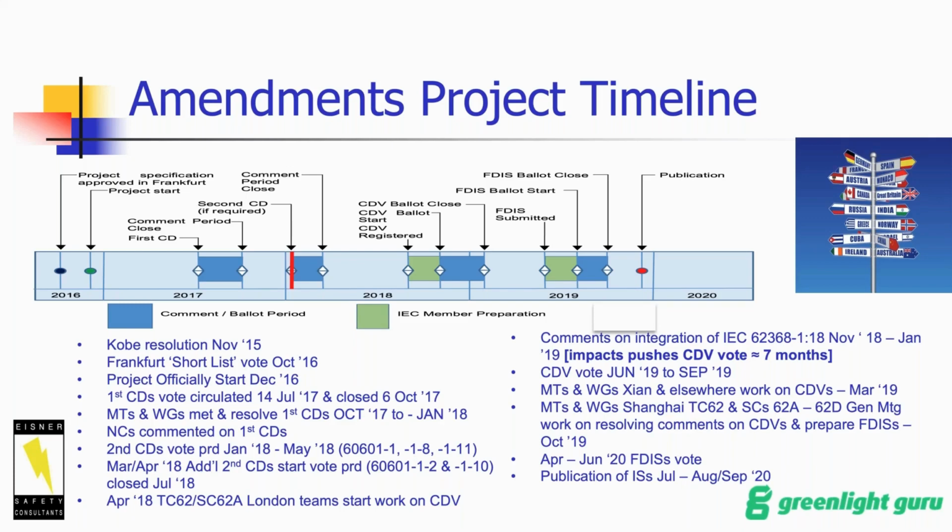For the usability standard, only 2 items were accepted. For the alarm standard, 20 items were accepted for the short list. For the closed loop controllers, 13 items. For the home use standard, 4 items were originally accepted for the short list. 1 was added later on. Don't ask me, I don't remember what it was. Then for the environmentally conscious design standard, which is barely ever used other than in Brazil, no technical changes. And for the EMS standard, which is such a new standard, there were no technical changes either.